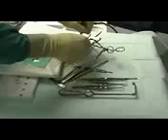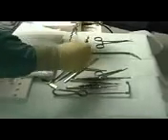Sterile instruments are useless if non-sterile covers are used. There are different options in terms of sterile covers. The use of disposable articles is safe, as these are sterilized by producers through radiation and are thus free of germs.